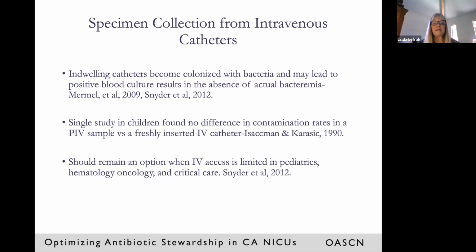The conclusion of this practice guideline is that using an IV to draw a blood culture should remain an option in the patient populations where getting an adequate sample is difficult, which certainly is neonatology, hem-oncology, and critical care. Next slide.